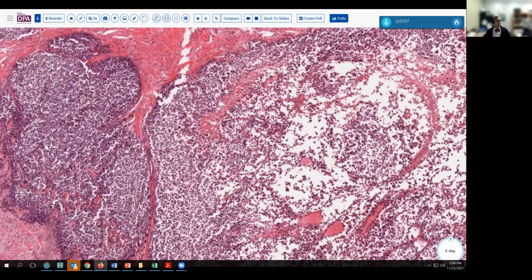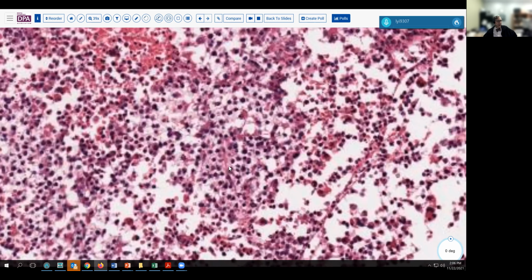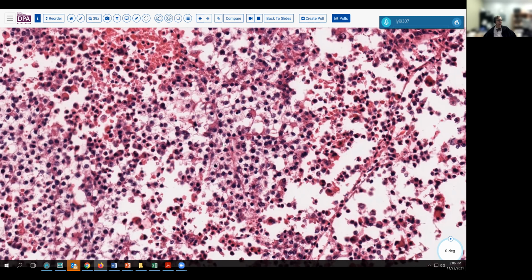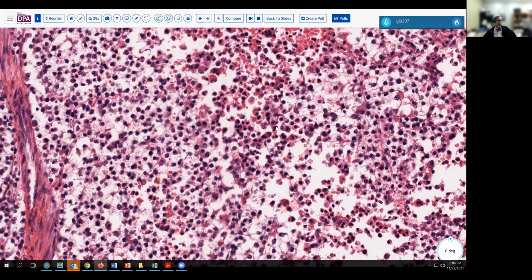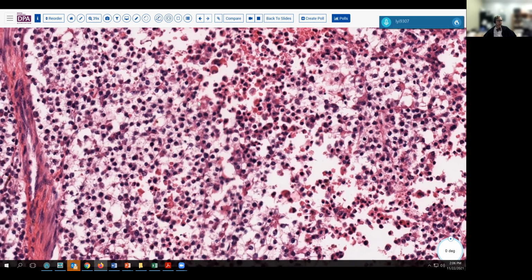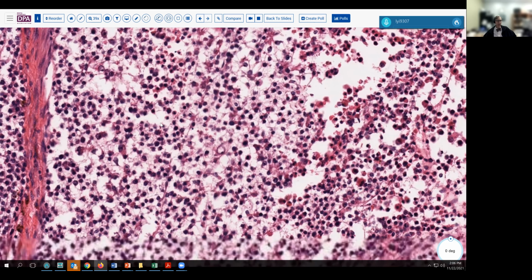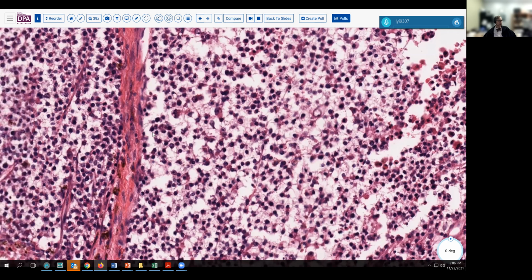This is a tumor where, as we look at higher magnification, we see a lot of clear cytoplasm, maybe cytoplasmic borders around these cells, relatively dark staining nuclei, and we might wonder about various epithelial neoplasms, maybe even renal cell carcinomas, other clear cell tumors as possibilities.